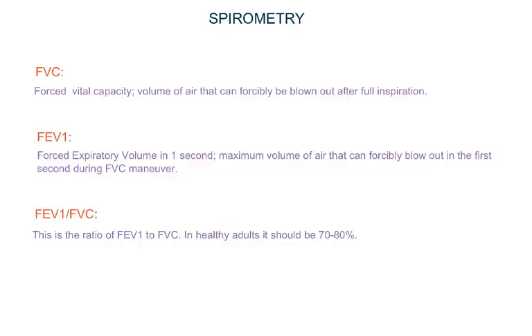The key measurements you should know to understand spirometry or lung function tests are FVC and FEV1. FVC is forced vital capacity. It is the same as vital capacity, but by definition it is the maximum amount of air expired after maximal inspiration.